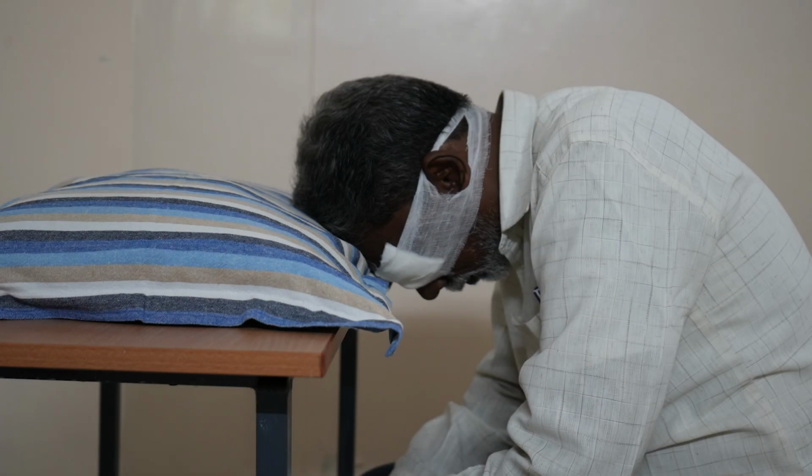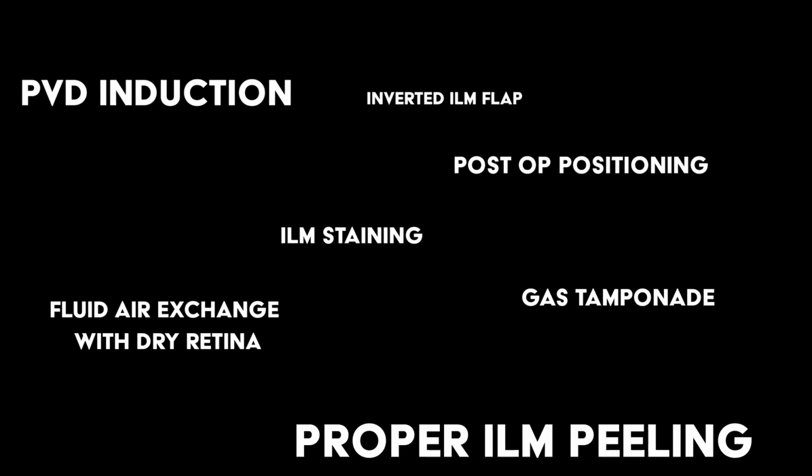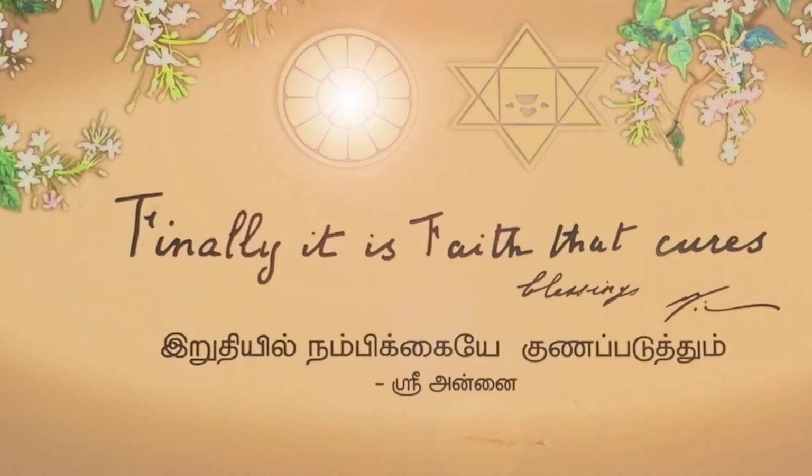Following a sufficient peel, a thorough fluid-air exchange is done. Ensuring a good drying of the retinal surface is necessary for macular hole closure. A non-expansile gas is injected for internal tamponade, followed by post-operative face-down positioning. By meticulously addressing each step, surgeons can achieve successful macular hole closure, helping restore visual function for their patient.